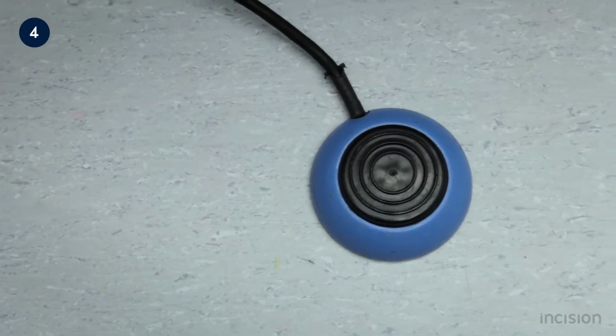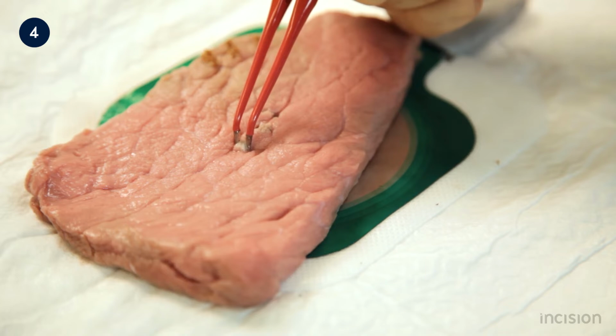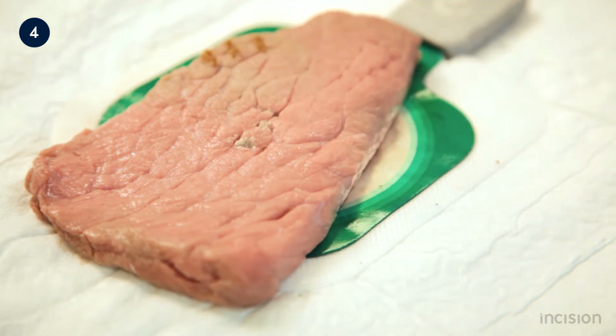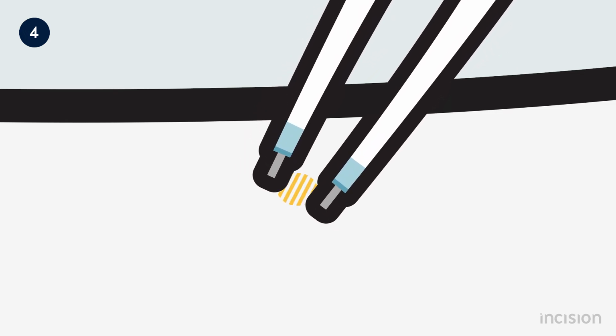The device can be controlled by a foot switch, or sometimes using an automatic start-stop mechanism. In this, the device is automatically activated when contact with the body is detected through its resistance, and deactivated when a coagulum is formed.